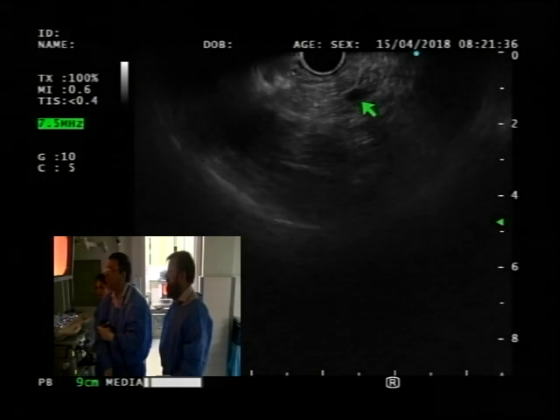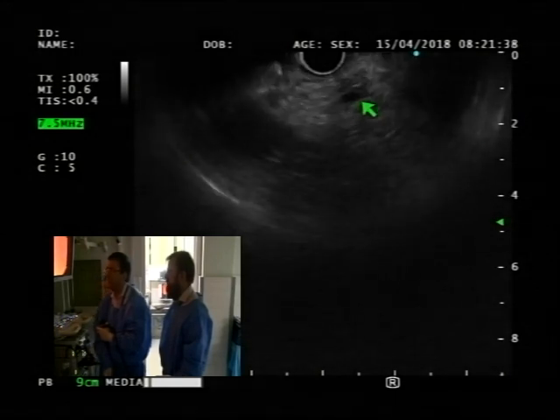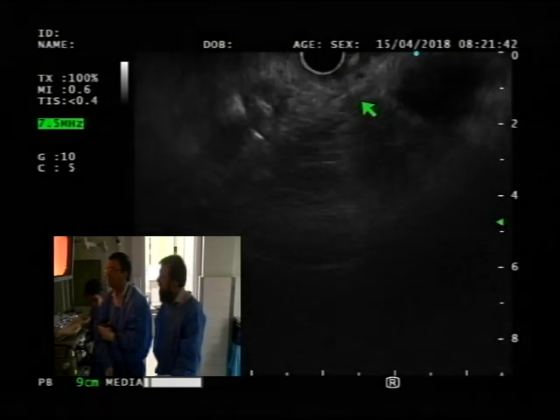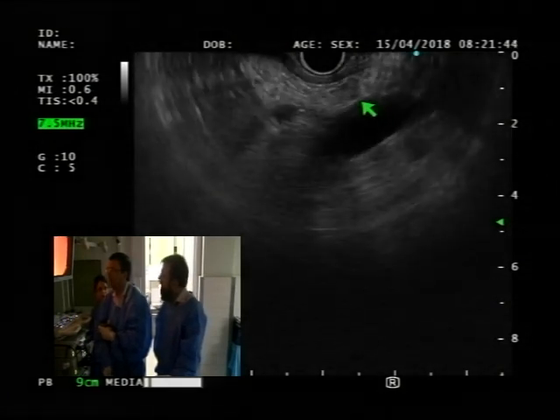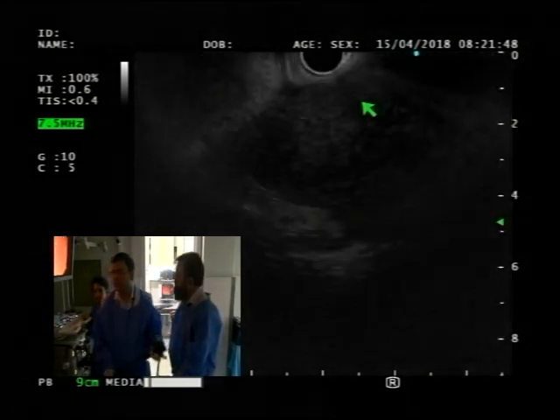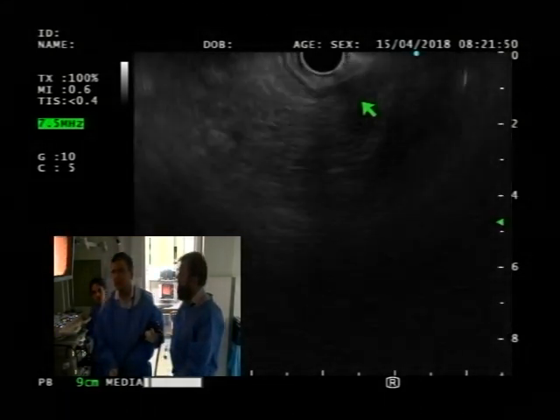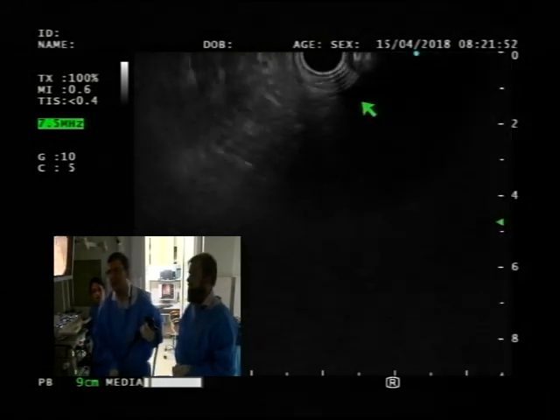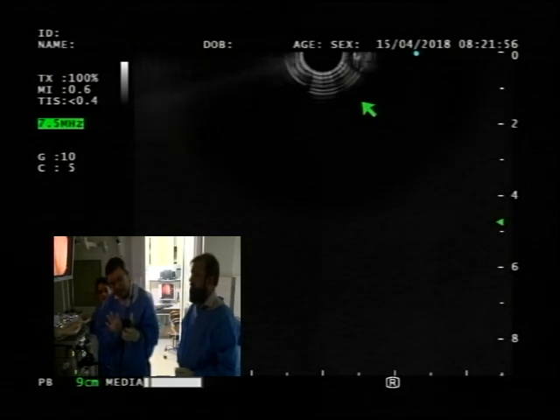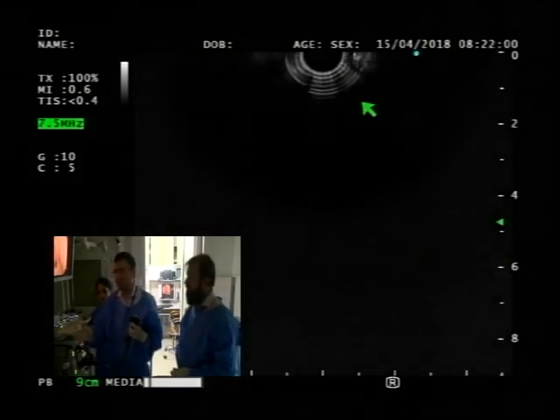And you see the bile duct right there? That's nice and clean. Also having non-cirrhotic portal hypertension, having varices. So Khalid, in D2, you just go from one movement to the other, and just a little pullback, and that's how you reach. And also make sure the wheels are unlocked at that point.